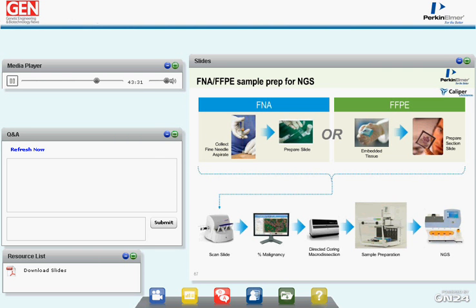This machine views the top of the FFPE block with a camera and aligns the H&E view of the slide with the top of the block, and then directs the TMA coring drill bit to those areas that were identified by a pathologist as tumor and pulls tissue from the block directly and places that tissue into a PCR tube for subsequent DNA extraction, etc. Andrew will be talking about these steps in slides after mine.